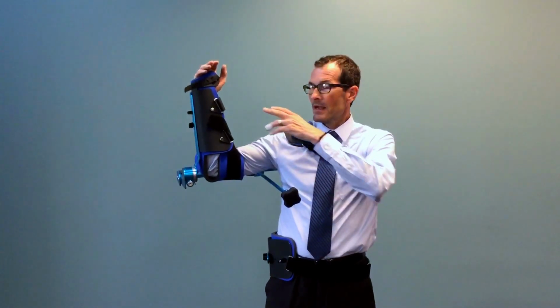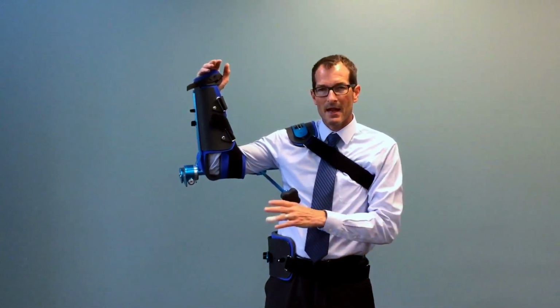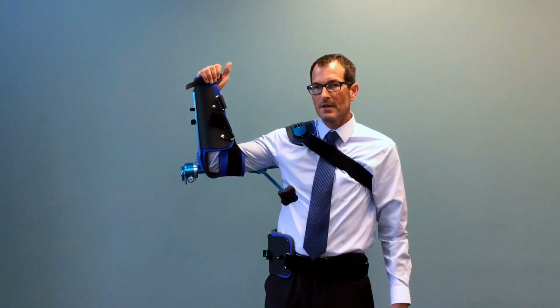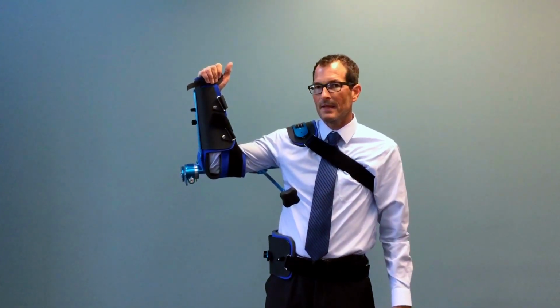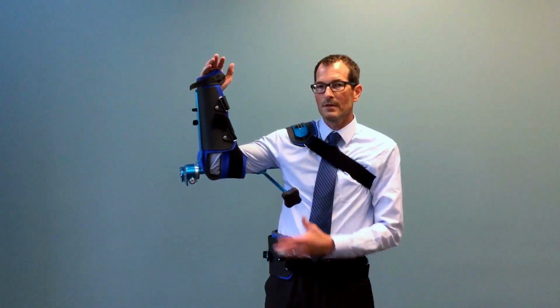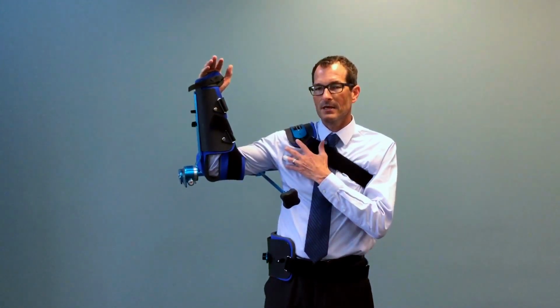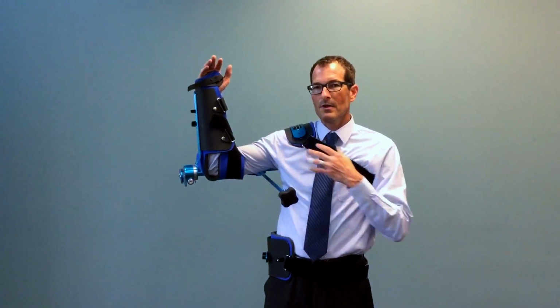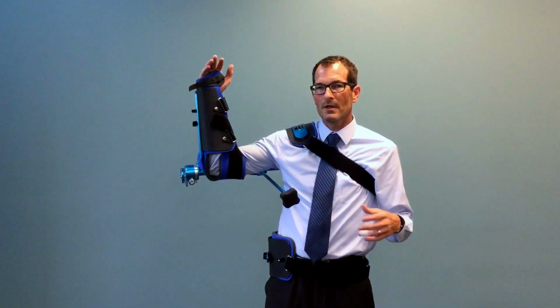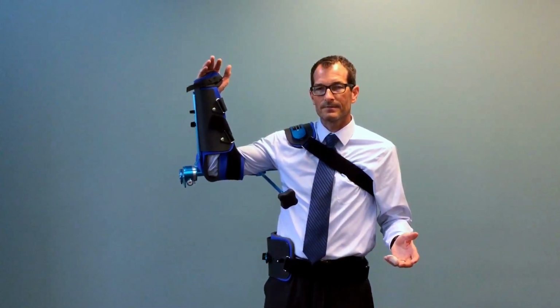So we saw some patients on our original design that did not have the elbow X-strap holding on to the edge of the cuff of their forearm splint, and that is no longer needed. The patient can completely relax their arm. Tricep and elbows harnessed well. Maximum relaxation occurs at the shoulder girdle, which allows the best amount of plastic deformation to occur in regards to when the patient makes their finite adjustments.